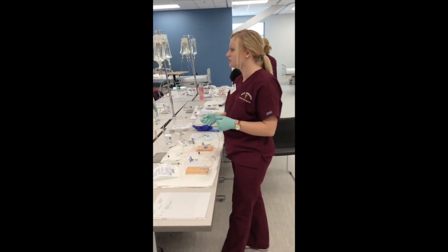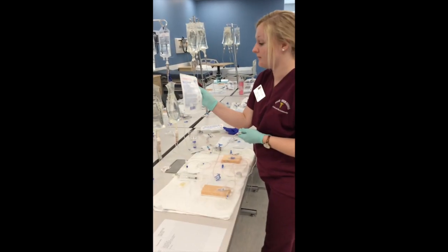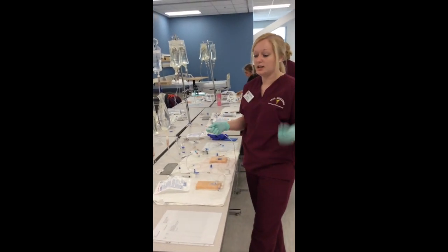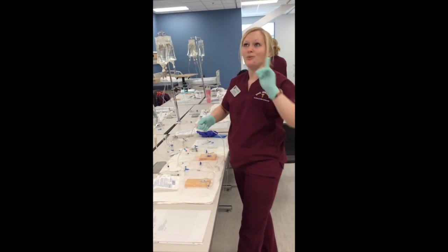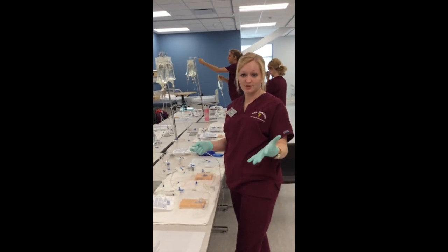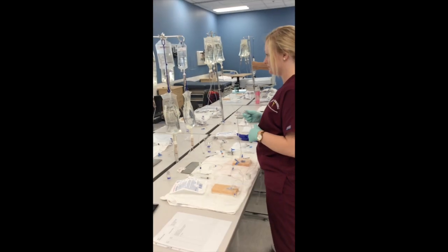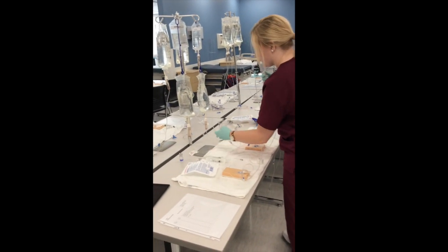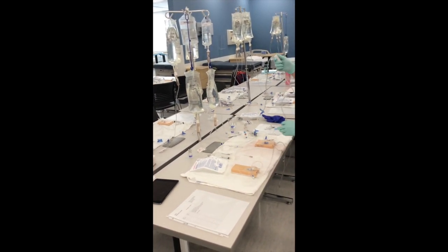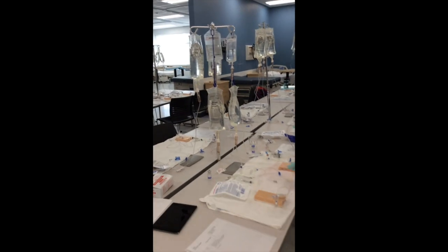So I have 125 milliliters to infuse. That's going to go over an hour, and my secondary drop factor is 10 drops per milliliter. So that ends up being that I'm going to need 1 drop per 3 seconds, and 5 drops for 15 seconds. So I'm going to go ahead and start calculating that. And then it should start to flip, and that's how I control how many drops go in. And then once I have that infusing, make sure that she feels it's safe.